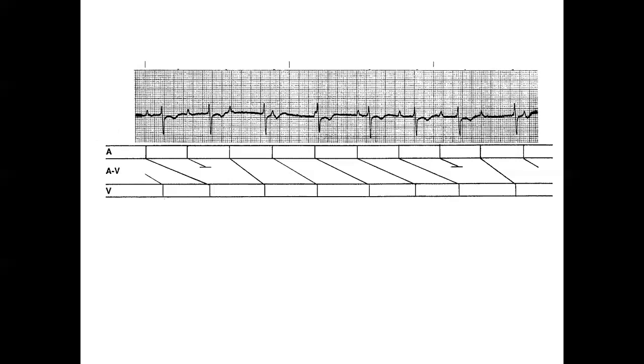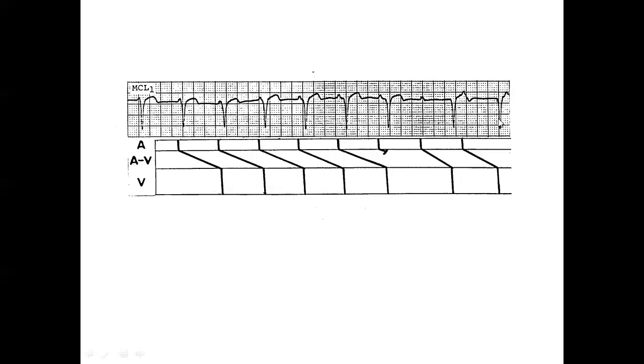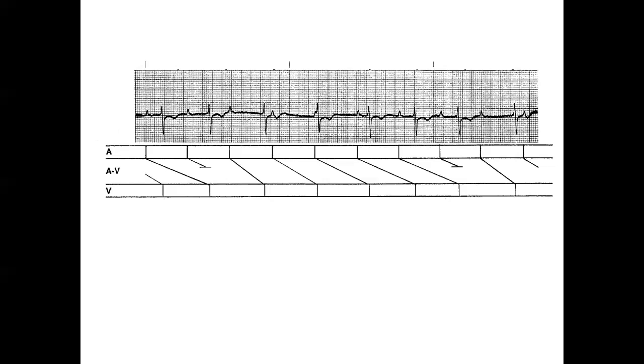And let's try again here. Okay, what is the long RR interval? So this is the first beat of the cycle. Then you look for P. What is the P? P should be in front of it. It's not there, it's not there. And, oh, it's there. It's long? Well, yes.